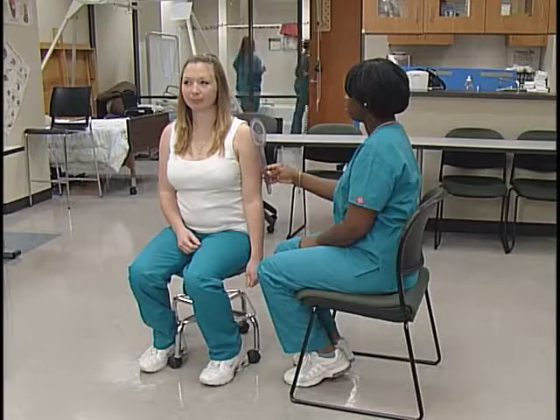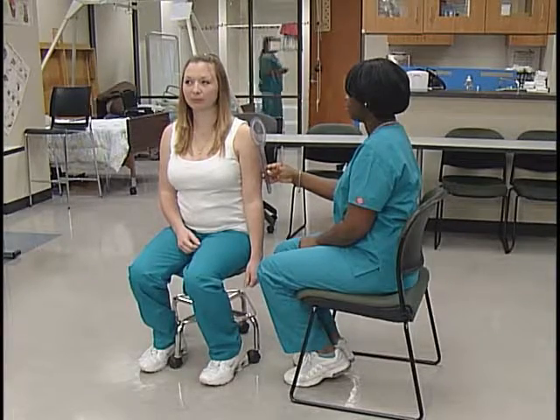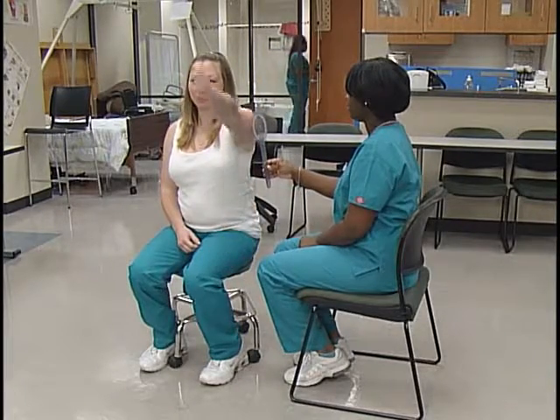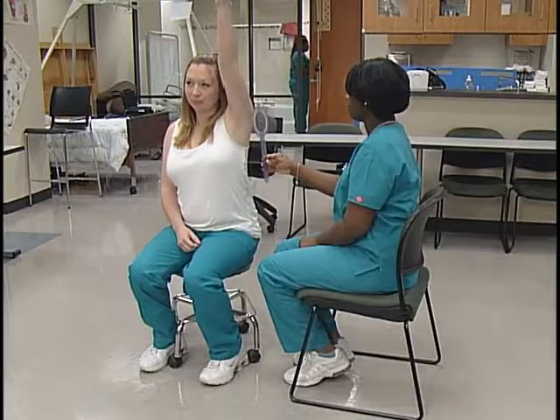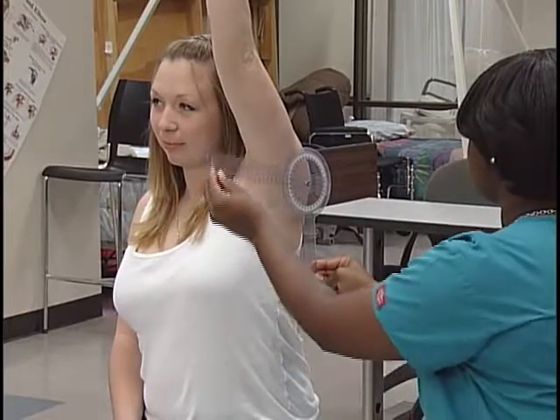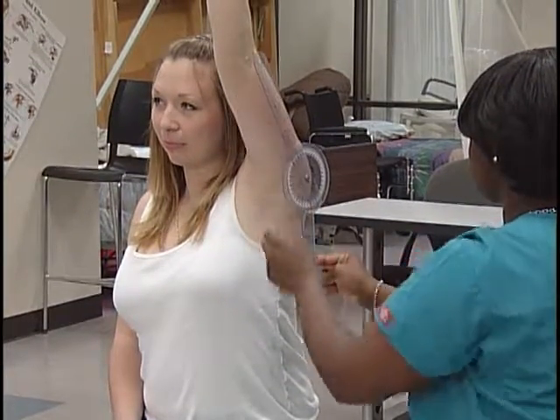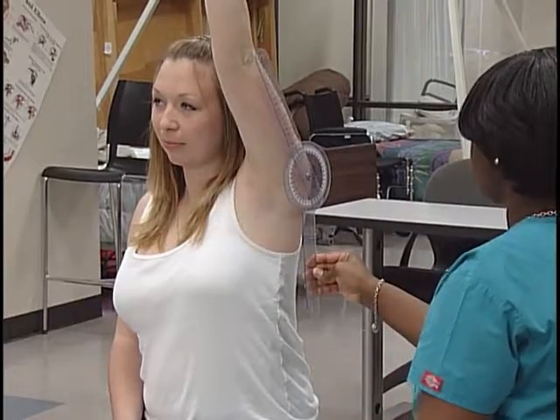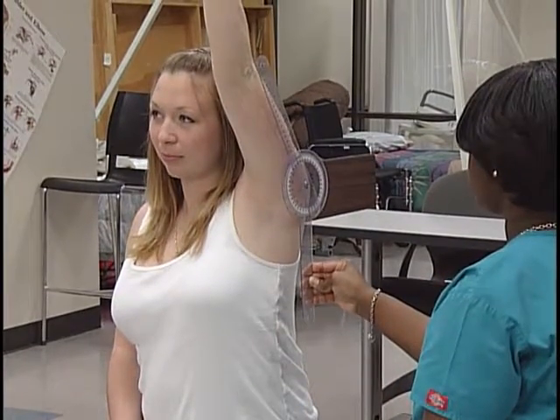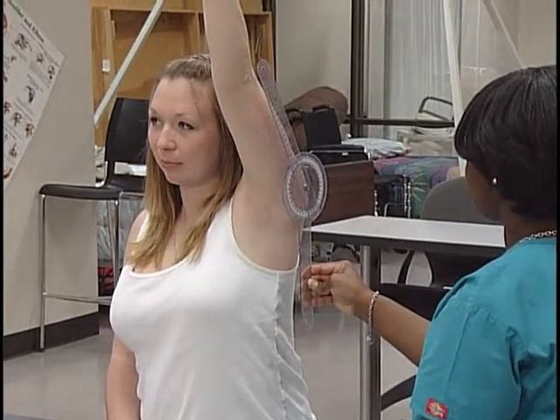The client's arm is raised in front of her body in a sagittal plane of movement. The measurement begins at zero degrees and ranges to 170 degrees.